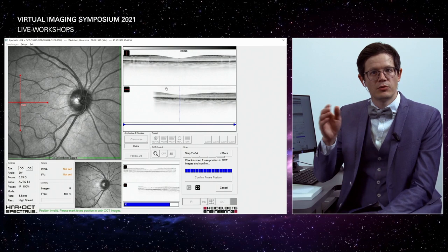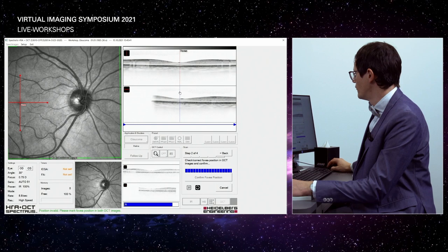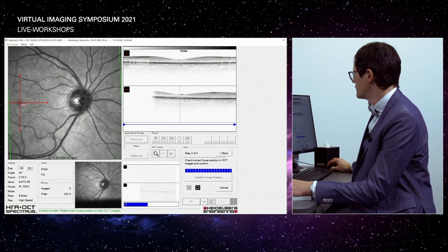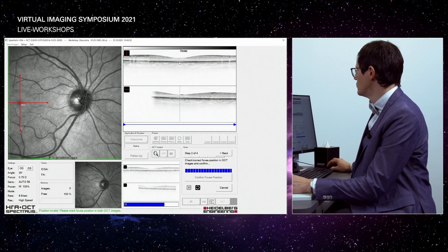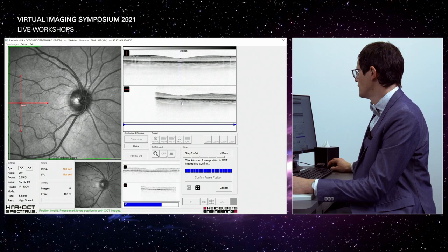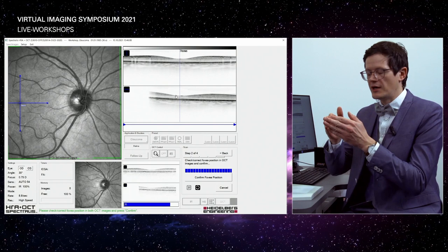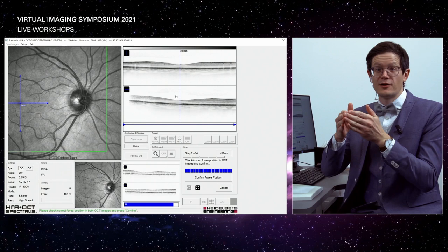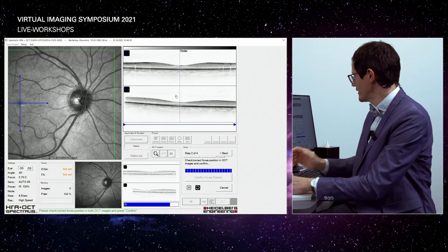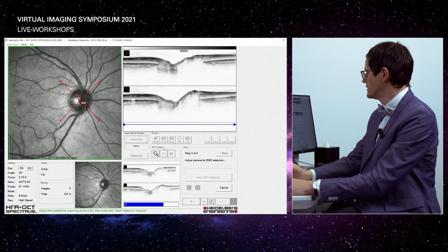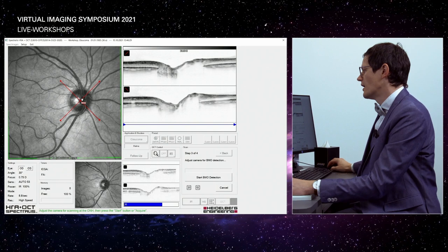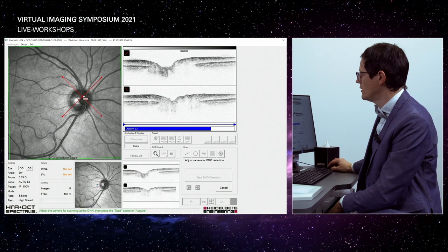After confirming the fovea position, the software asks whether the second line is still correct. If I move one vertical line, the other may turn red. You must click precisely on the line itself to confirm it. Once both lines are confirmed, in the third step the cross moves from the fovea to the optic nerve head. For myopic patients, this cross may not be perfectly centered on the optic nerve head, and you may need to move it manually to the center before clicking 'Start BMO detection.'